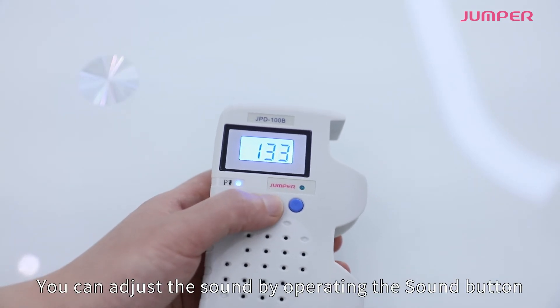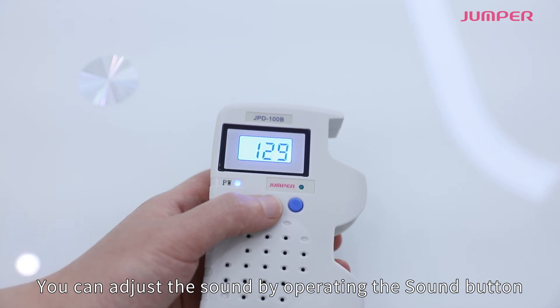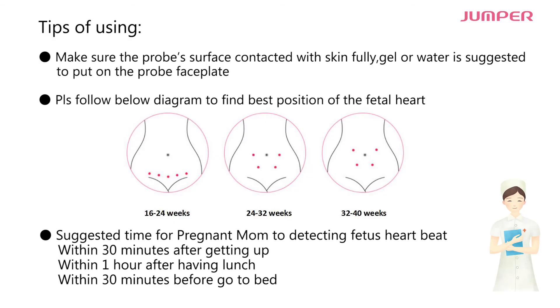You can adjust the sound by operating the sound button. Tips for use: make sure the probe surface is in full contact with the skin. Gel or water is suggested on the probe faceplate. Please follow the diagram below to find the best position of the fetal heart.